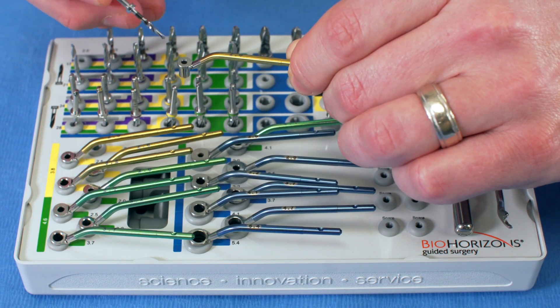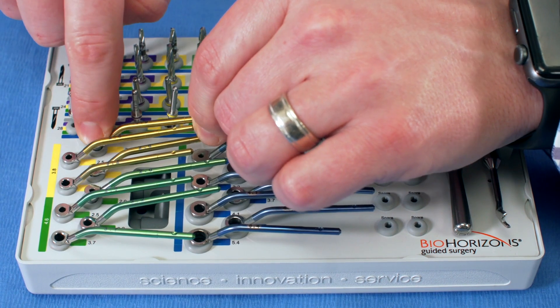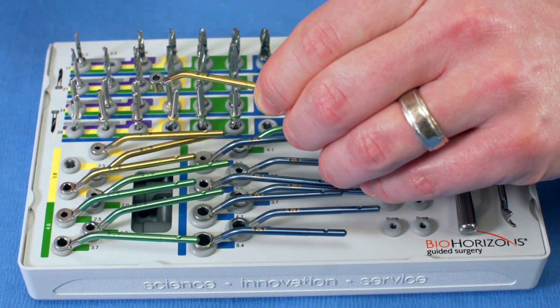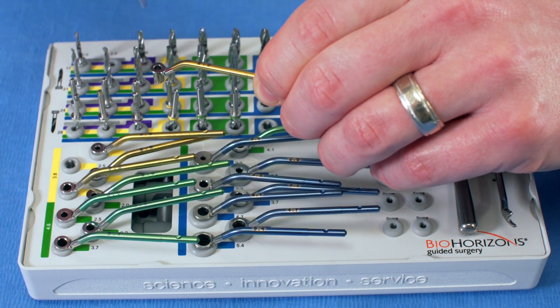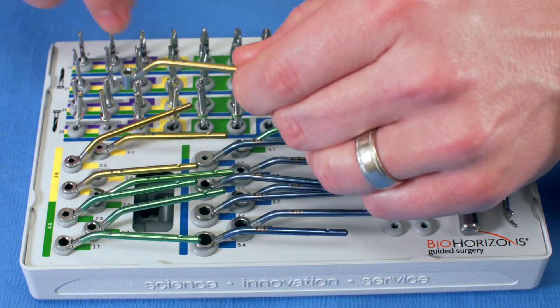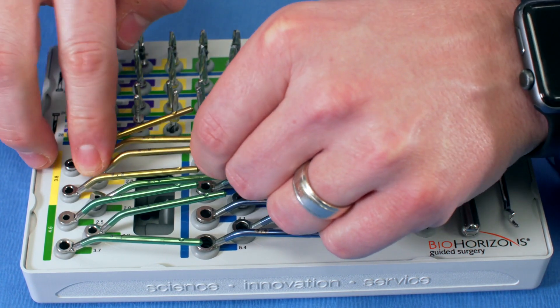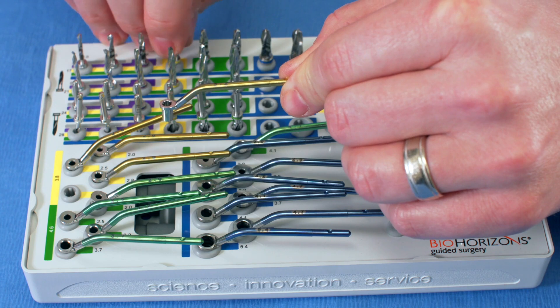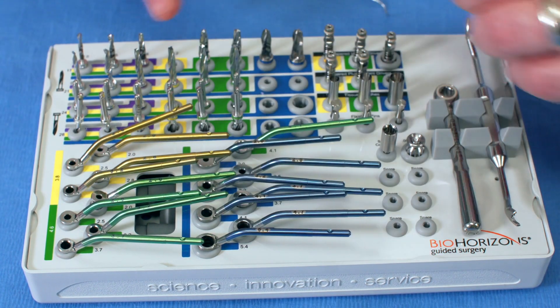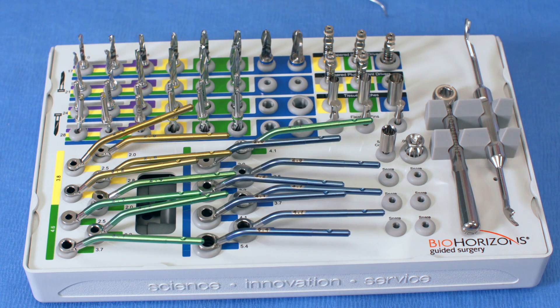You still have to watch your depth markers — the length lines remain the same. With a surgical guide and implant sleeve, you place the key in the sleeve, then drill to the appropriate length. For a yellow-sized implant at 12 millimeters, you'd use the 2.0 with its key, then the 2.5 key, then the 2.8 key and drill to 12, then pick up the final 3.2 guide key and drill to 12 millimeters. It takes two hands — one for the key and one for the drill. BioHorizons has plans to release a keyless guided system, but at this point this is their guided system.